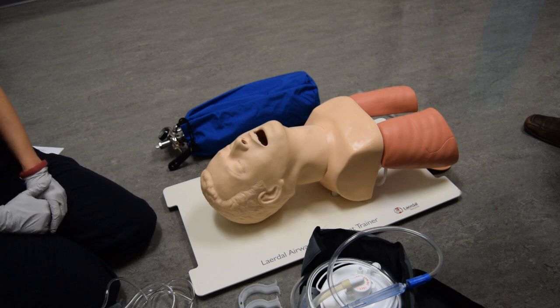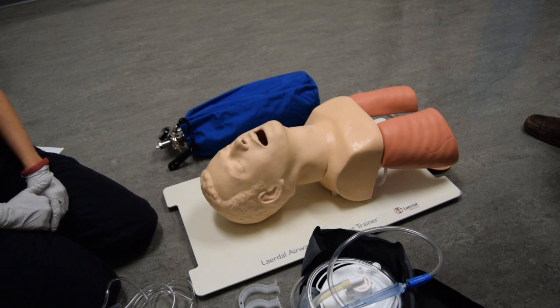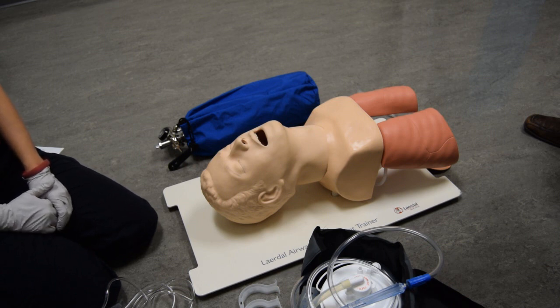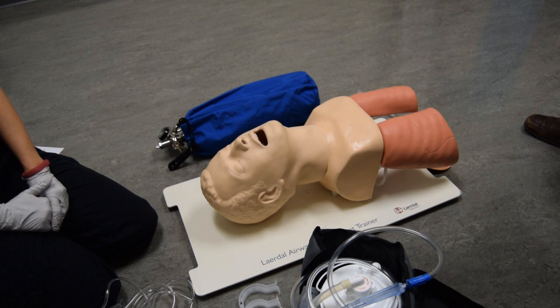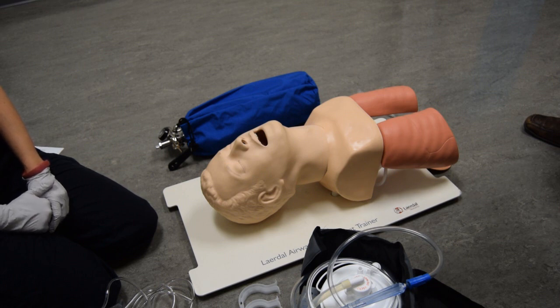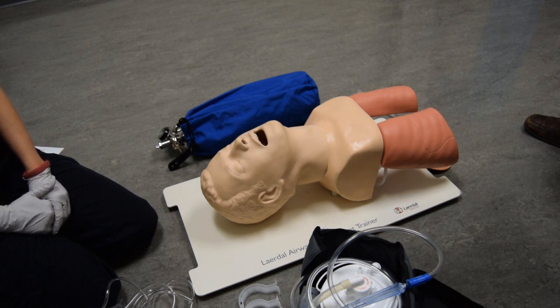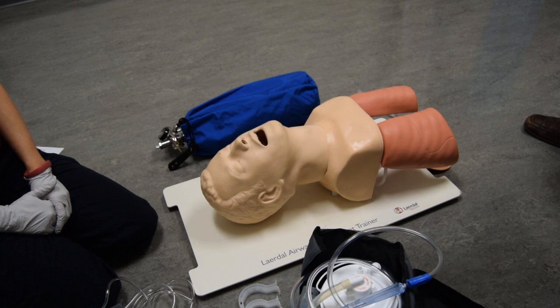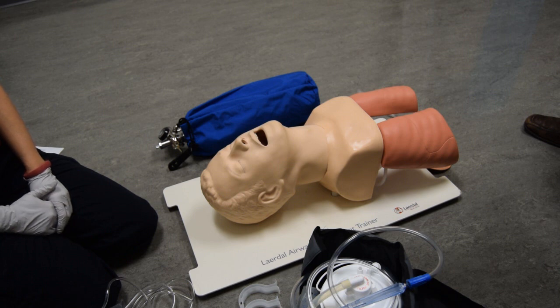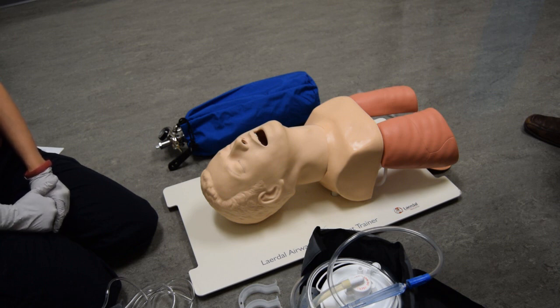You're required to demonstrate sequentially all procedures you would perform from simple maneuvers, suctioning, adjuncts, and ventilations with a BVM. You must actually ventilate the mannequin for at least one minute with each adjunct and procedure utilized.